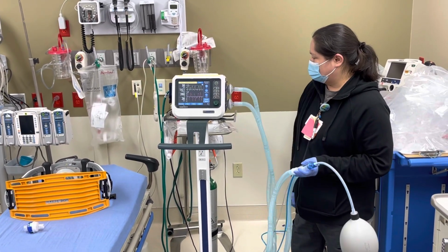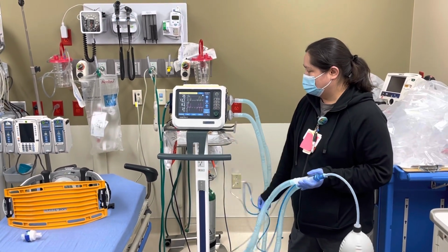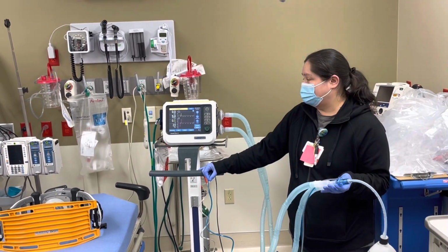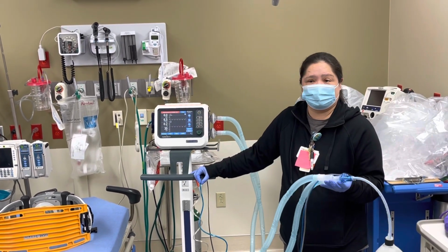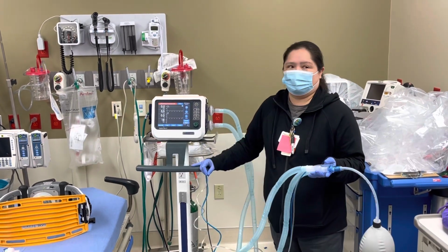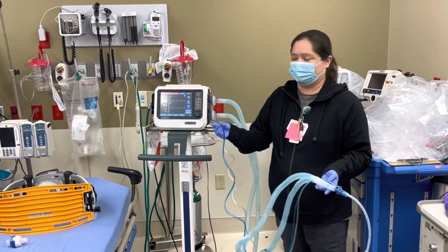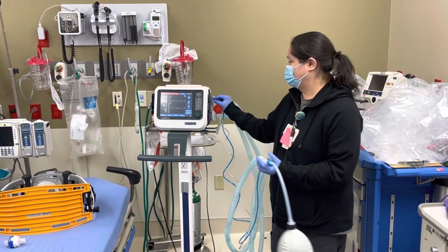And this is another issue that will happen whenever you disconnect these. Once it starts losing flow, or what it thinks is flow, it's going to mess up and start telling you that it's not getting anything. So you're going to be looking at your patient thinking, oh, are we extubated? What happened? And everything looks perfectly fine. Start looking back through your circuit, because a lot of times one of these will get pulled out.